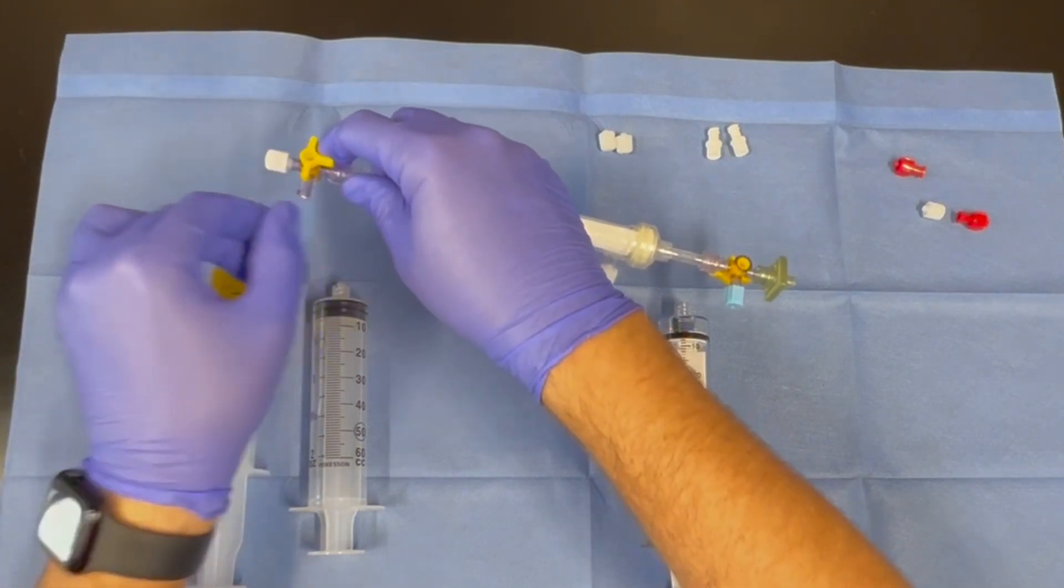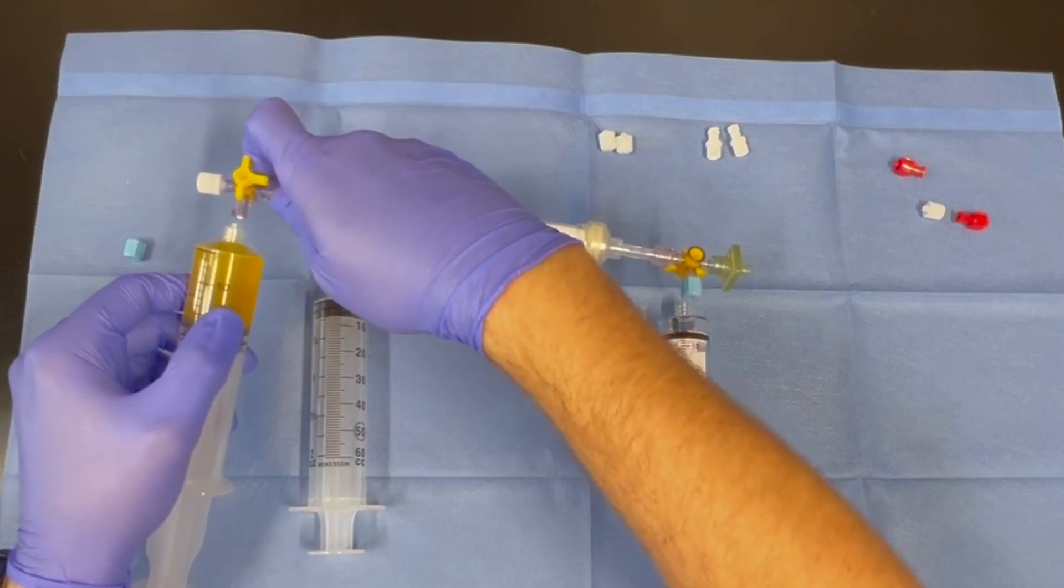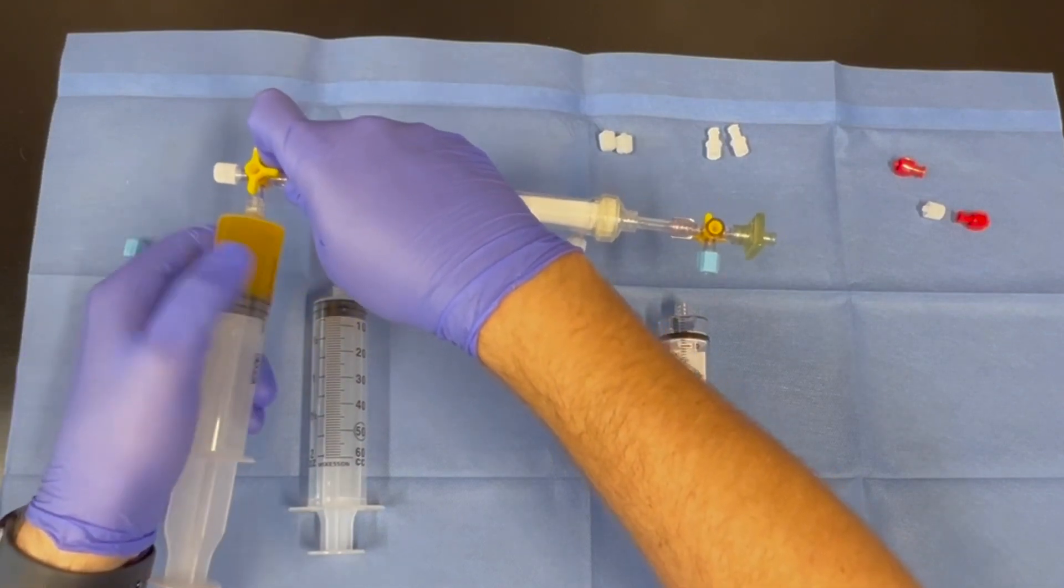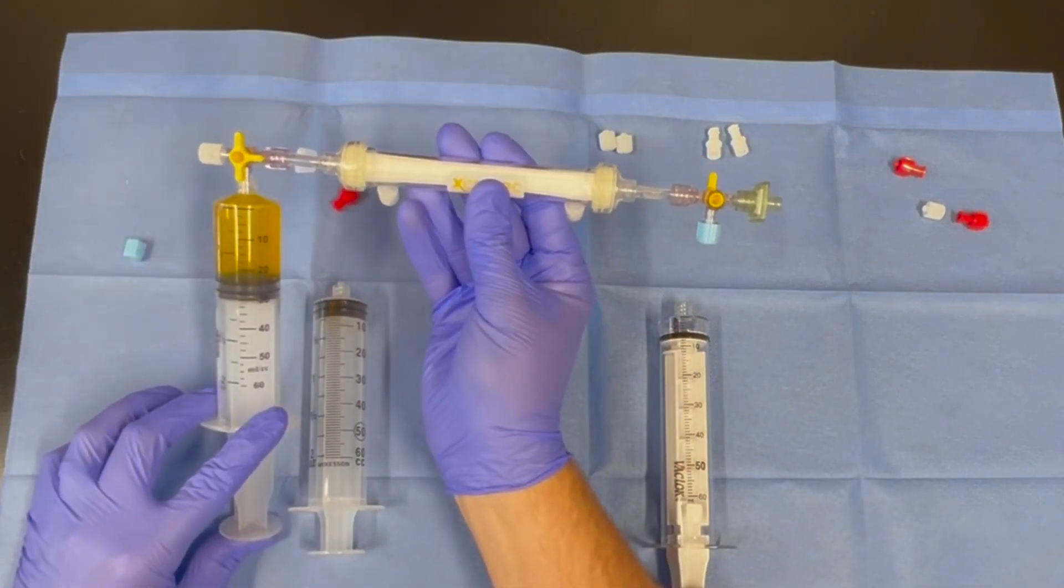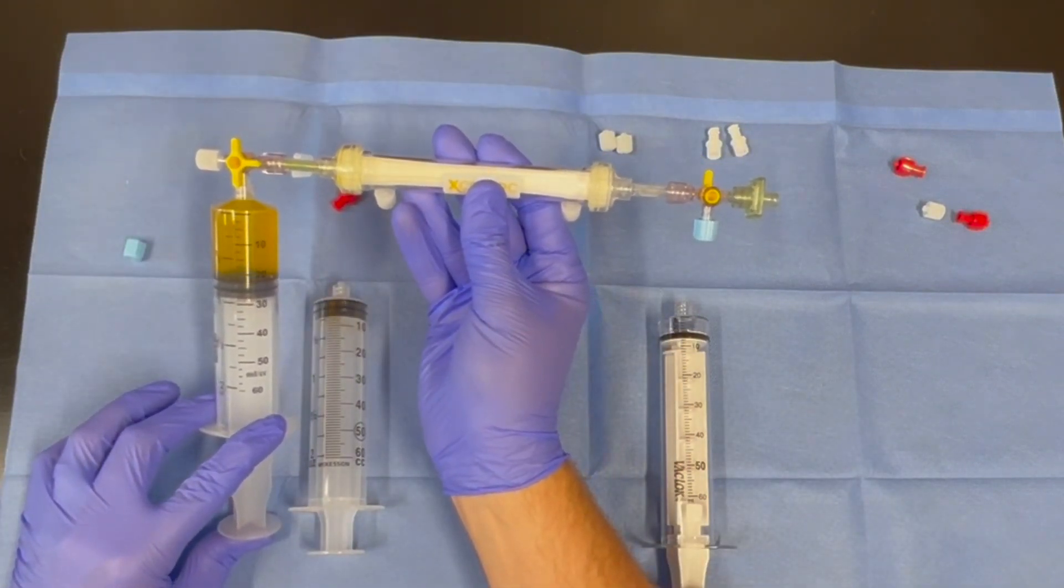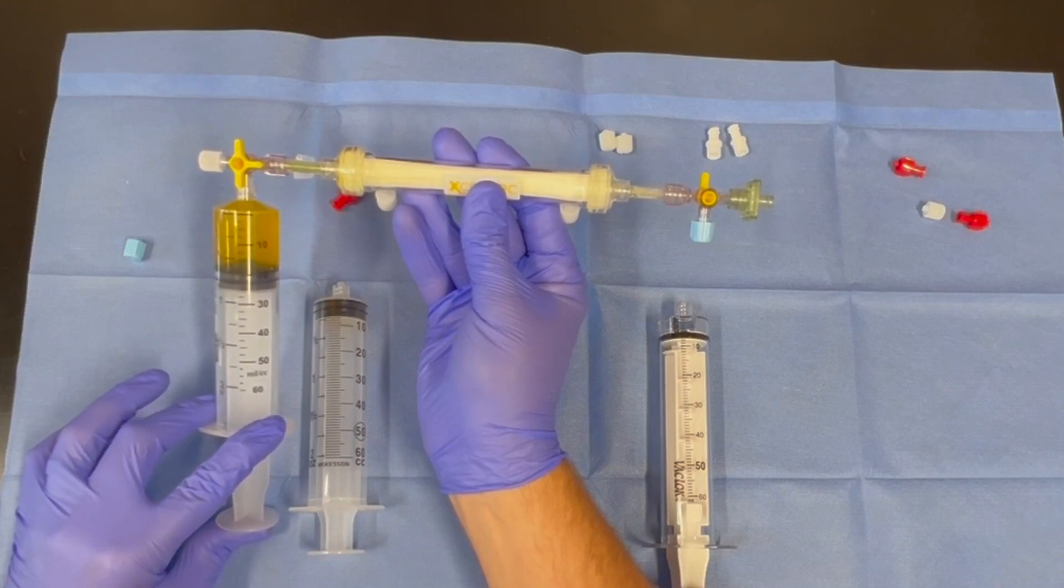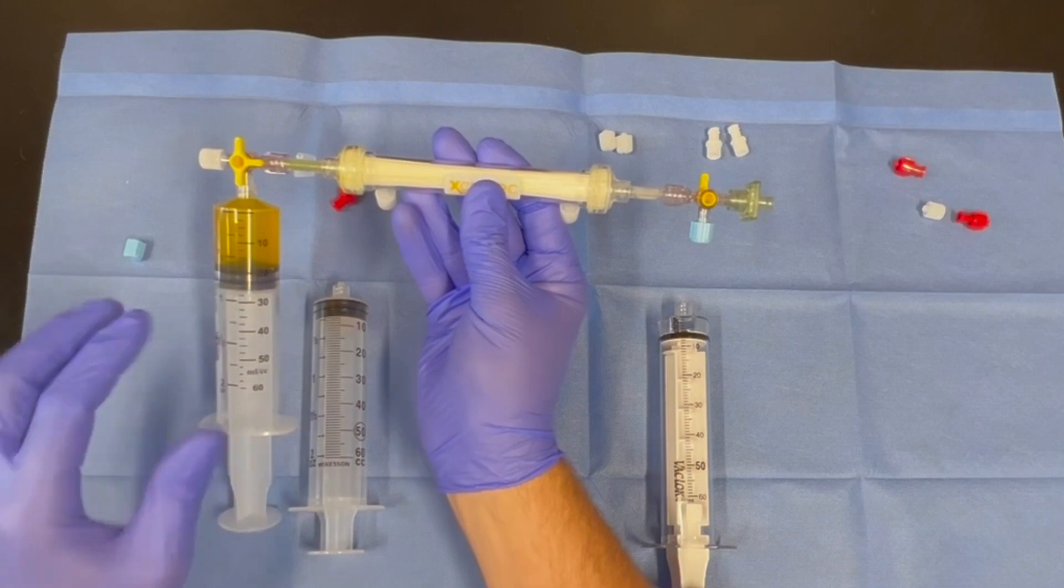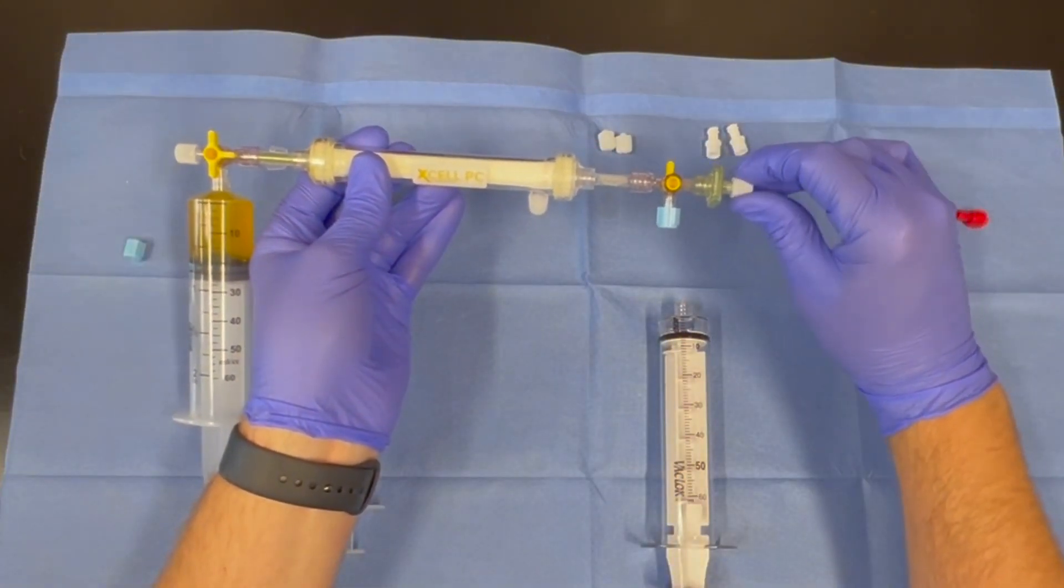Remove the blue cap and attach the 60 ml syringe with the platelet-poor plasma. Push any remaining air in the platelet-poor plasma through the main filter and out through the green filter. Once the air has all passed through, the plunger will no longer advance. At this time, recap the green filter.